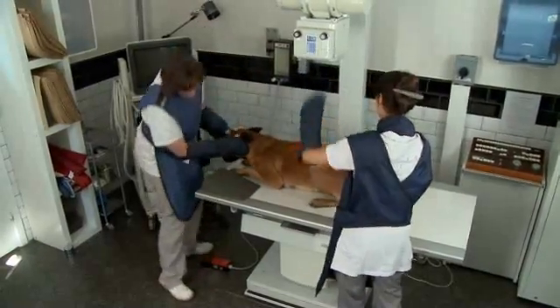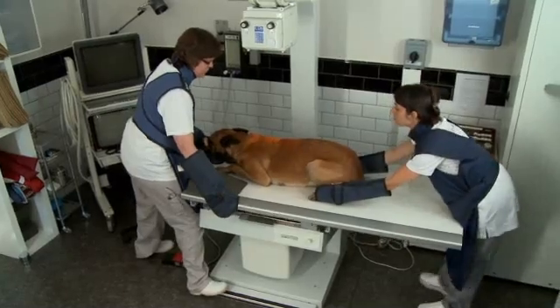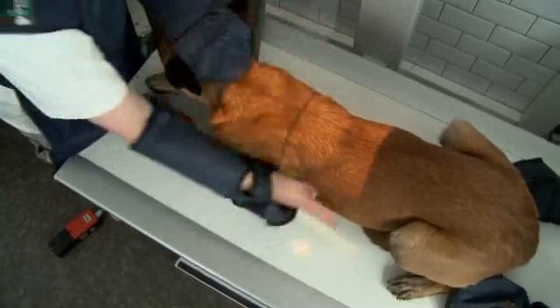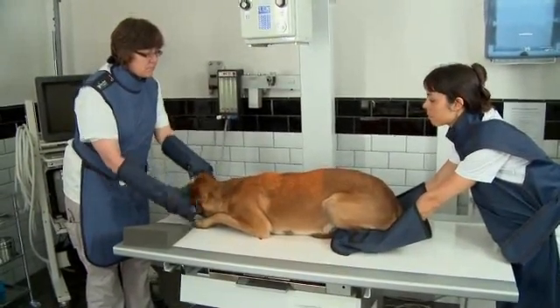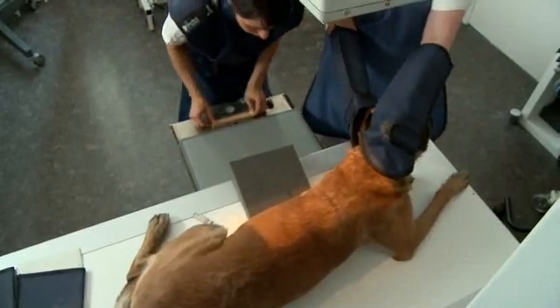Once the dog is perfectly positioned, we will minimize moving him and instead we will move the table. We will center the light beam just behind the caudal edge of the scapula, and the center is represented by the cross of the window, which will focus just behind the caudal edge of the scapula.